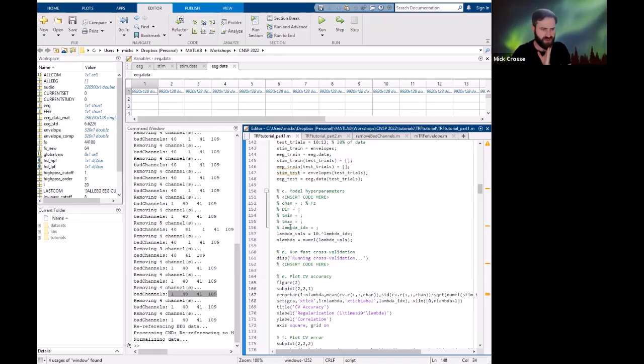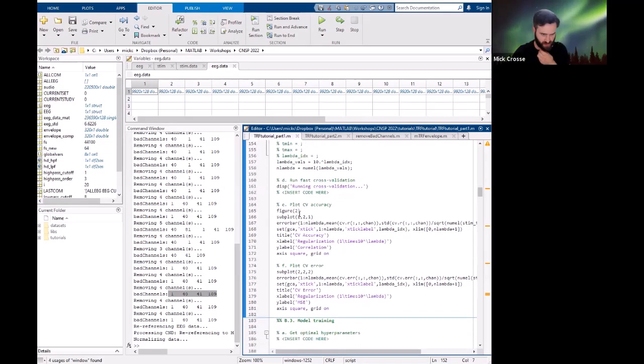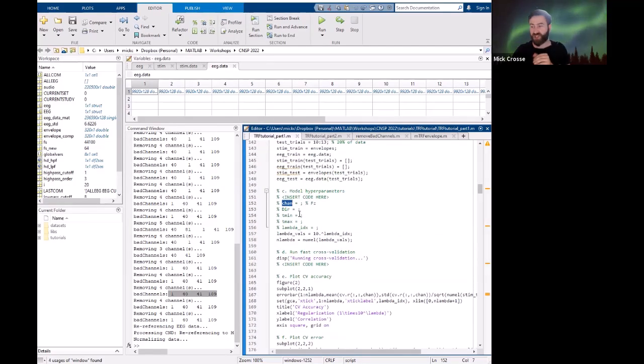There's a few different parameters we need to define here. We need to define which channel we are going to essentially base our analysis on. You could pick a range of channels, you could do the analysis on all the channels and then somehow try and consolidate it, or you could pick one important channel like FZ, which is what I've recommended here at the top of the head. So we'll have to define what FZ is.